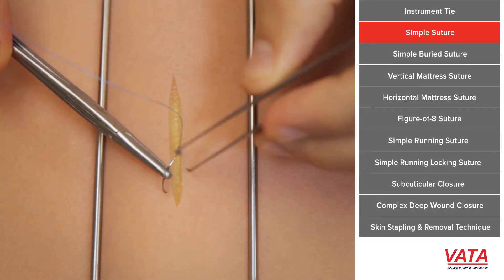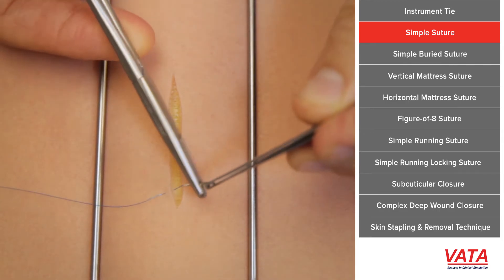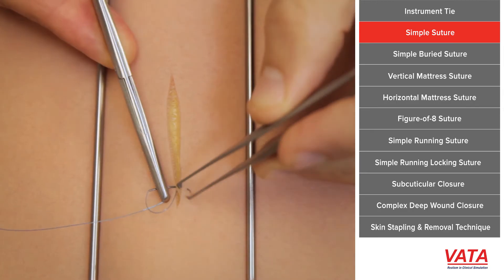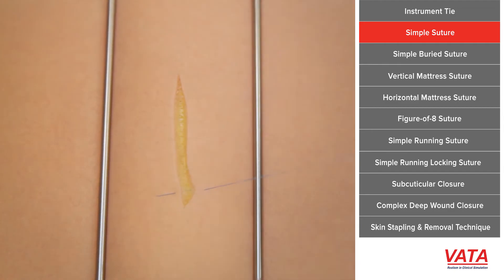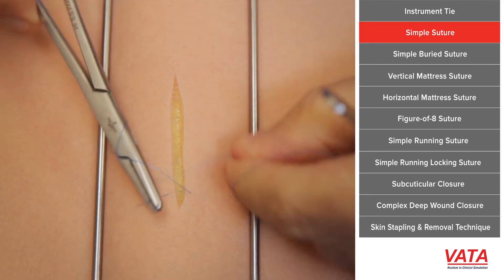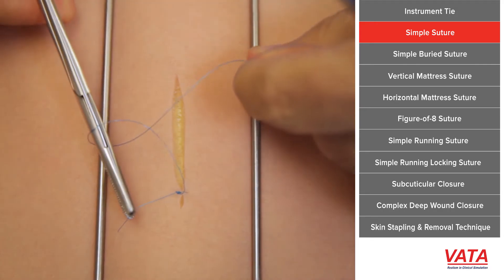The first suture I want to teach you is a simple suture — simple because there's really only one part to it. You're simply going to put the needle in on one side and then put it through on the other side. It's important to hold the needle in the middle, enter at 90 degrees, exit, and then enter again — come into the tissue and come up at 90 degrees. Having it at 90 degrees on both sides means when you tie it, it will approximate the skin beautifully.